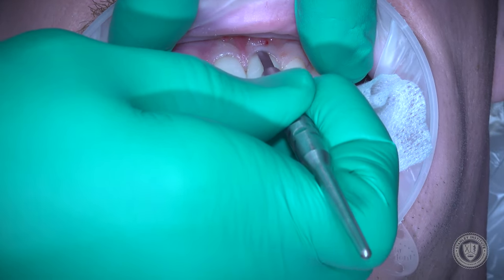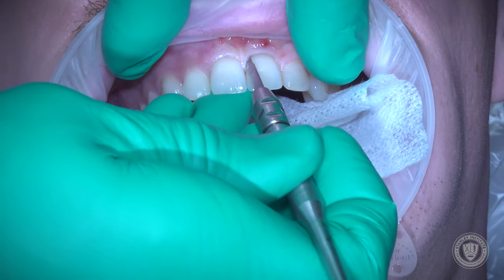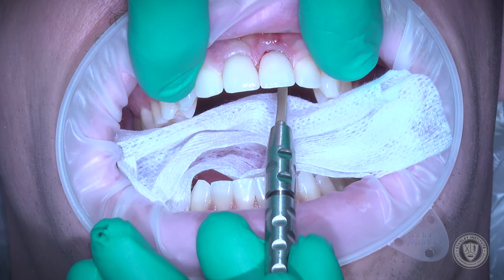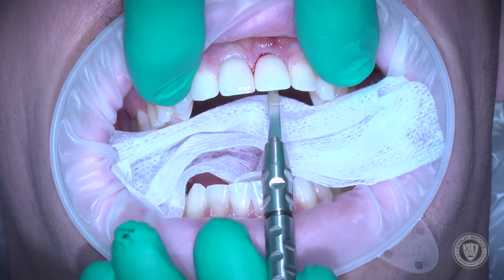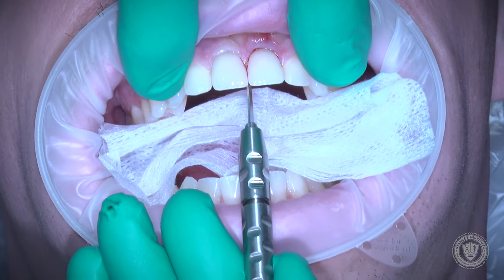We start with an intrasulcular incision with this microblade, being very, very gentle with the soft tissues. We're not actually going to elevate this tissue, and you'll see why in just a second. We start on the facial, then go to the lingual, and separate all of those fibers around the neck of the tooth.